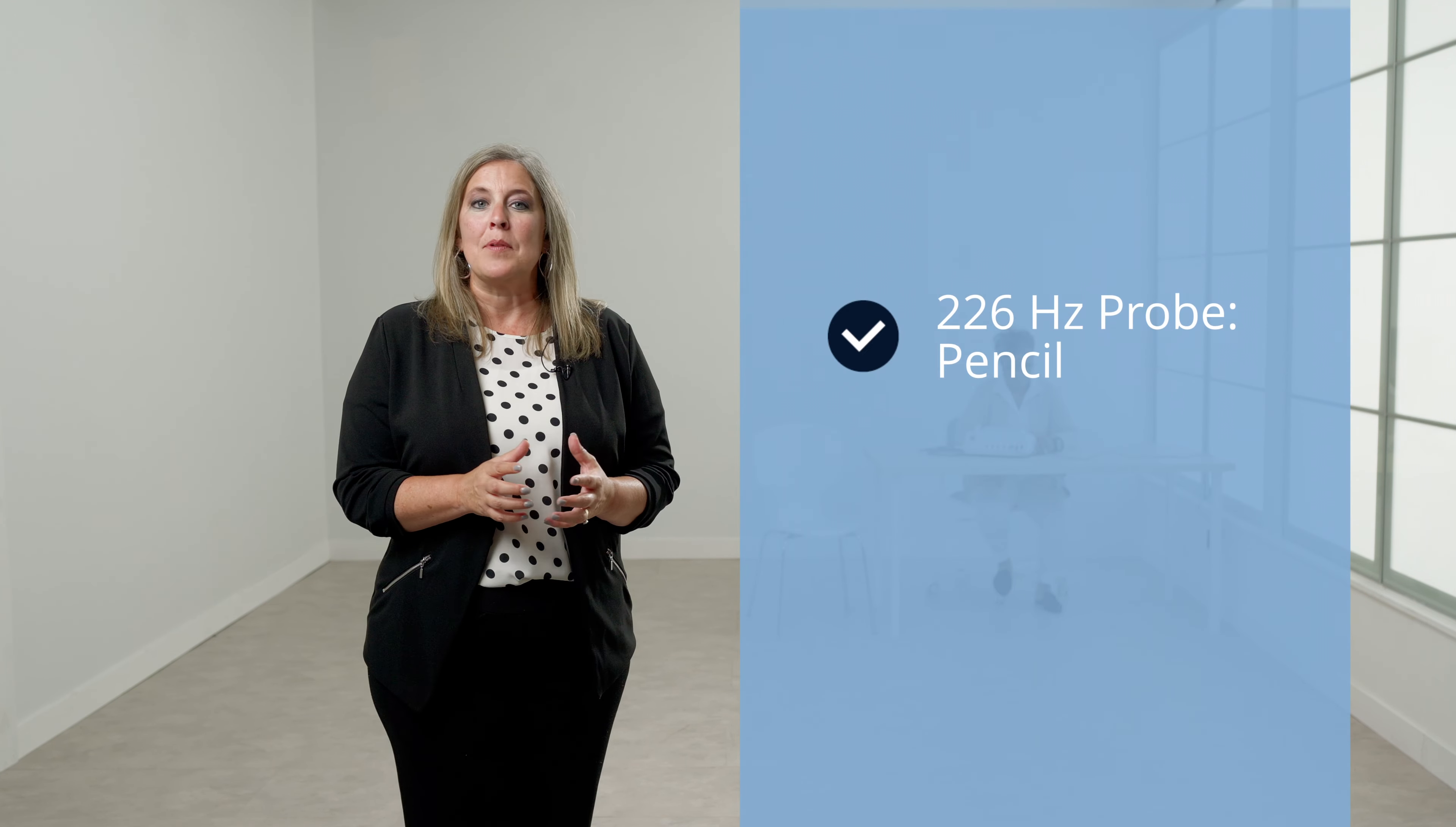If the orange light is illuminated, a pressure leak has been detected. If the light is a solid yellow, the probe is obstructed and should be removed, inspected for debris, and reseated at the entrance of the ear canal. If there are no lights, the test is complete.